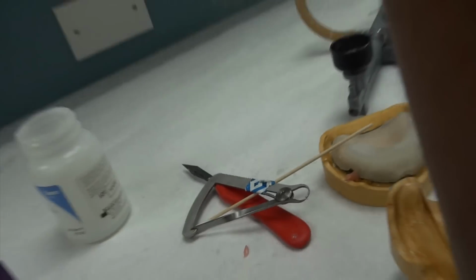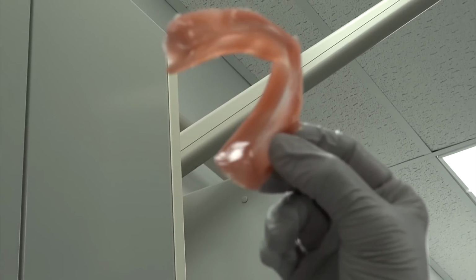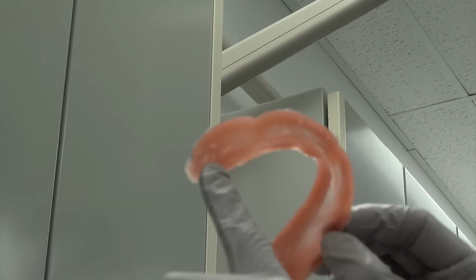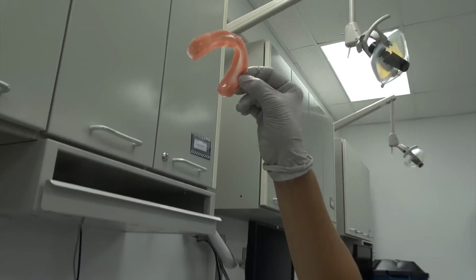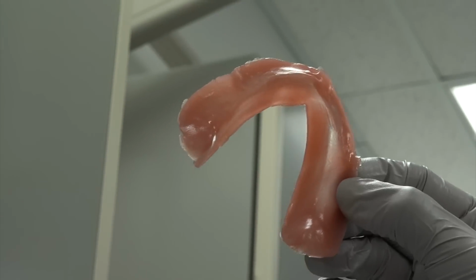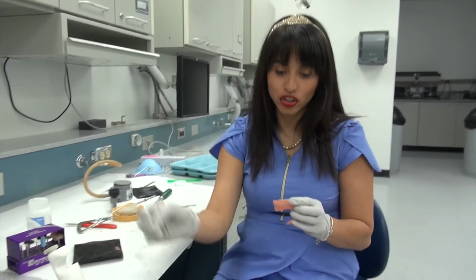And you see how pink that is right there? So being able to identify your differences in color: too thin, just right there, getting on the too thick side, thickness, but perfect thickness in the appropriate area, but still translucent. But see how this is not translucent at all? Because that's your 3.5 that you're aiming for. Okay, now once you do that, all you need to do is trim it up.